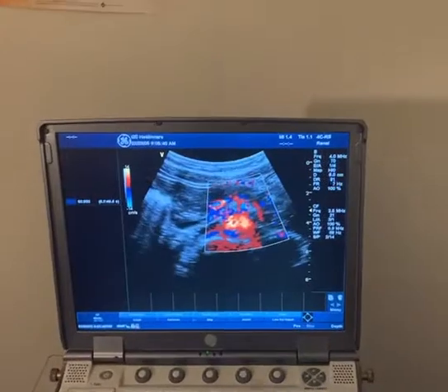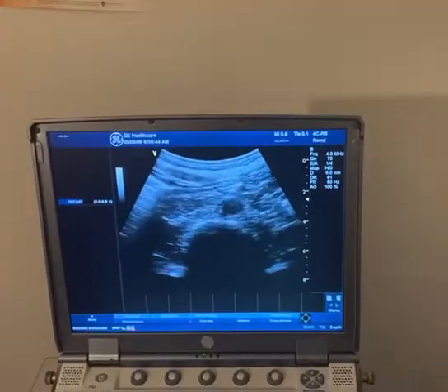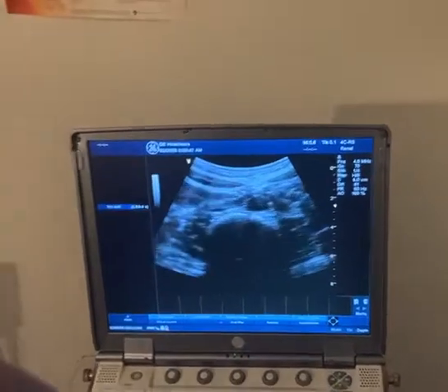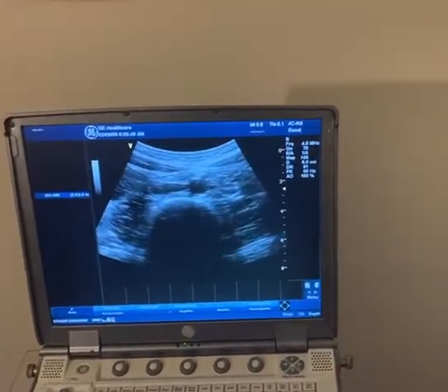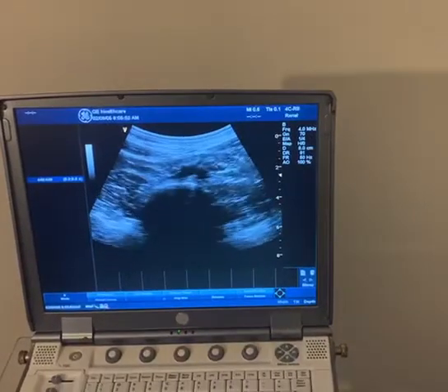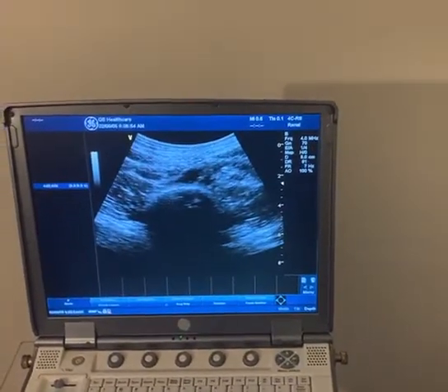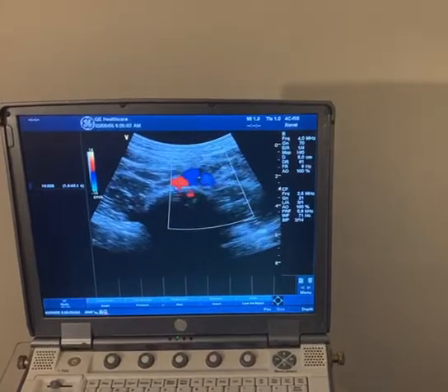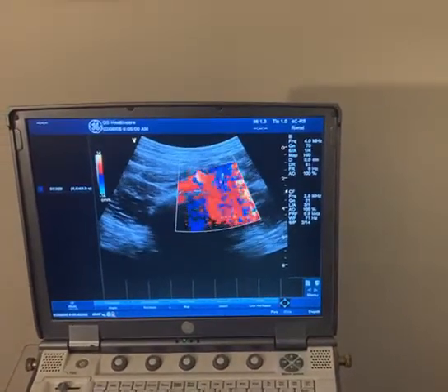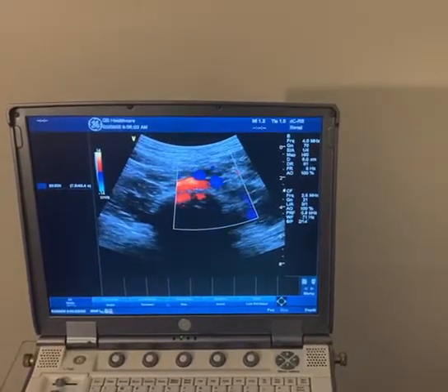I'm going to take the color off and just keep following that aorta all the way down. As I'm going down the abdomen, I'm right at the level of the umbilicus. I'm going to keep going until I see my bifurcation. You can see the bifurcation right at that segment. I'm going to put color on it again so you can appreciate the bifurcation — you can see that in the image. I'm going to take color back off.